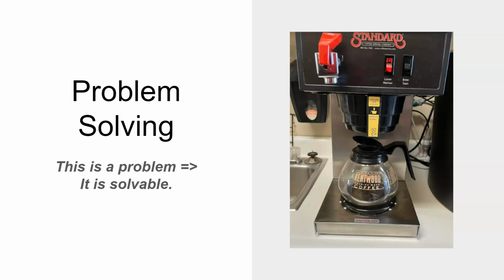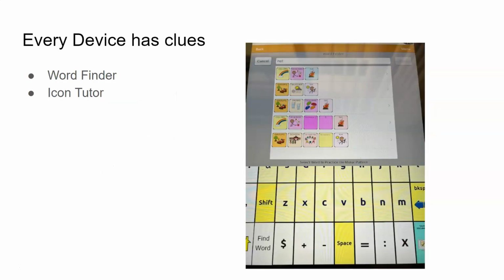Problem solving, troubleshooting, learning, it all takes practice and willingness to say, oops. The most successful way I have found to teach problem solving is to allow others to see you mess up and make mistakes, and then to narrate your problem solving process. Devices look overwhelming. That's what I think anytime I see a new system. It's not familiar, so to me, it's a bit scary.